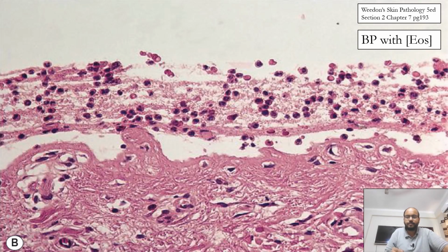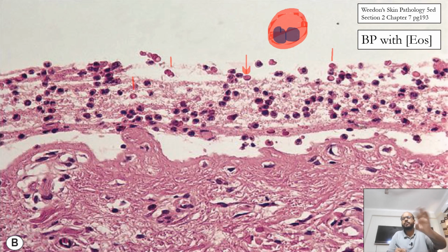Let's move on. So we have essentially expanded that area to look at our precious cells, eosinophils. This is an eosinophil. Can you easily recognize that eosinophils are nothing but red stained cells with roughly two lobes of nucleus, and you can easily see so many eosinophils, perfect eosinophils. So an eosinophil rich inflammatory infiltrate with a subepidermal blister, think of bullous pemphigoid.